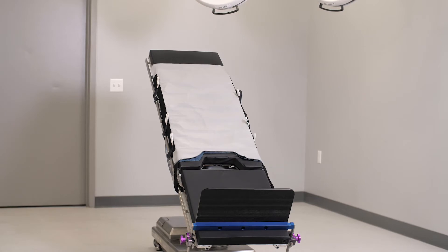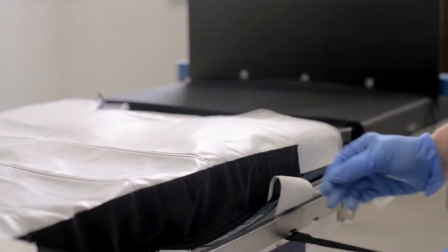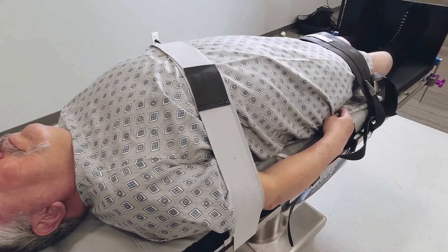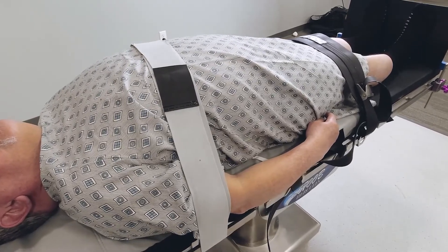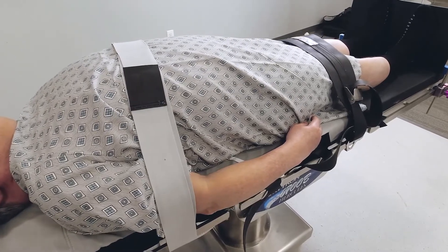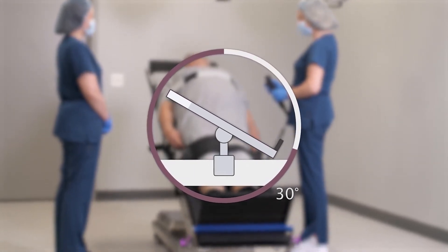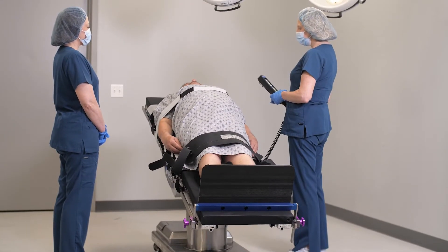For Reverse Trendelenburg positioning, first make sure the footboard is in place. Ensure the rail fasteners are looped after the rail post. Connect the patient safety straps across the patient's chest, followed by a strap placed around the patient's legs at mid-thigh level. Follow your hospital's protocol as appropriate and follow all other instructions as described previously for Trendelenburg positioning. Then move the table into Reverse Trendelenburg. Once the procedure is finished, return the table back to a flat supine position.